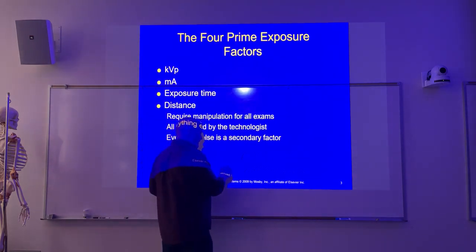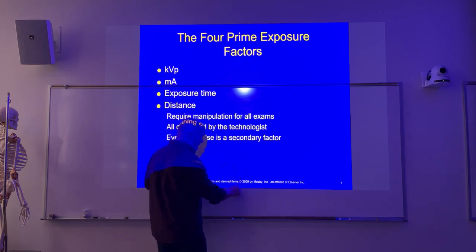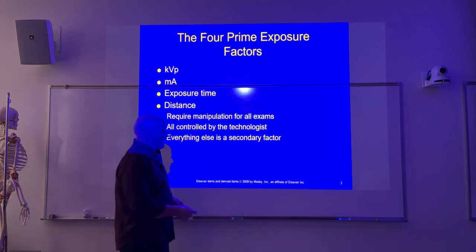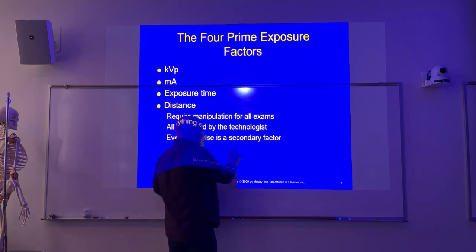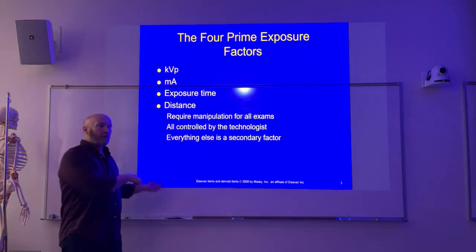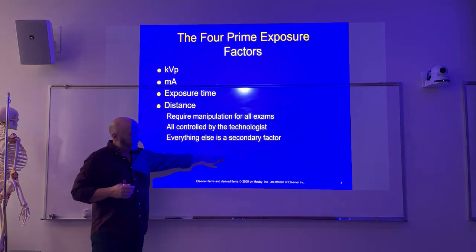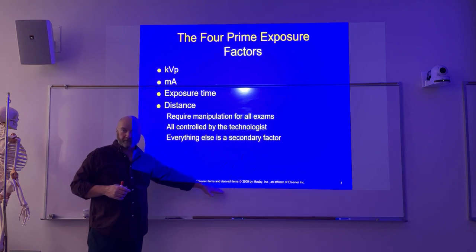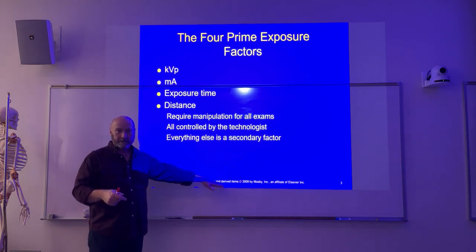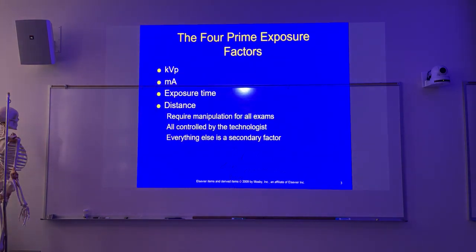So on high frequency, we had less than 1%, right? Three-phase 12 pulse, we have 3 to 4%. And then we've got 14% for 6 pulse. But up here, what we have is 100%. All right? So we have 100% voltage ripple, which is a lower output than these down here. Okay? So it's more ripple, less output, than less ripple. Does that kind of make sense? Okay. So I didn't want you to get home and look at that and say, that seems kind of backwards. Not really.